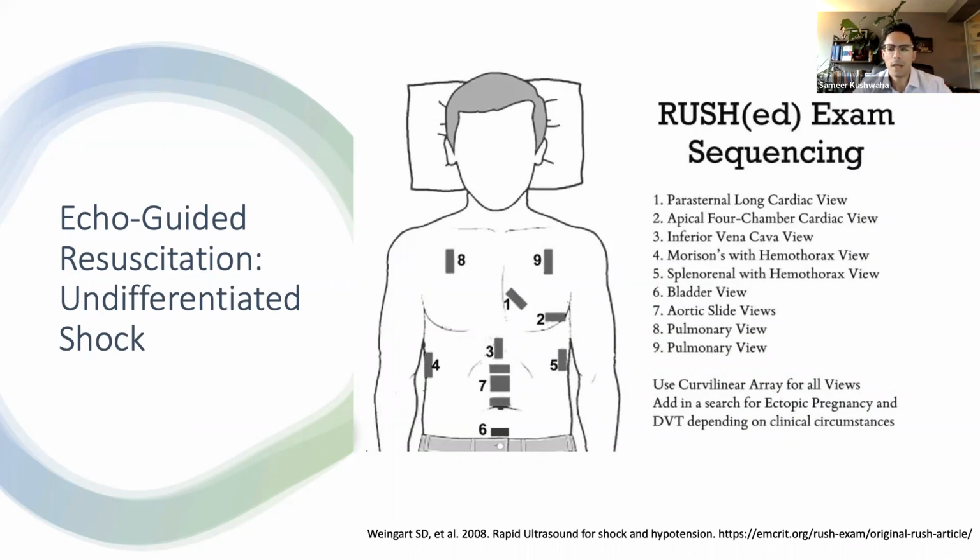This is a newer, but not that new model that I've heard of from a few people, called the RUSH exam. It's a bit more comprehensive than the FAST exam and includes the three main cardiac views at the parasternal long axis, apical four-chamber, and subxiphoid areas, as well as the areas that are seen on the FAST exam, the hepatorenal, splenorenal, and bladder spaces. And then it includes a sliding view along the abdominal aorta and two pulmonary views. And in doing so, can identify almost any of the major causes of shock, and with some practice can be done within a few minutes to take a quick look for any evidence of blood or pneumothorax or other free fluid.